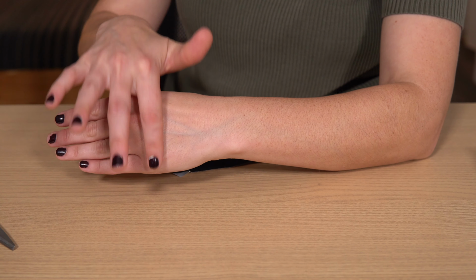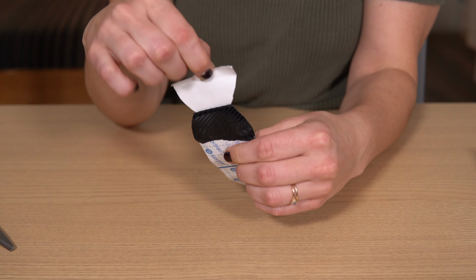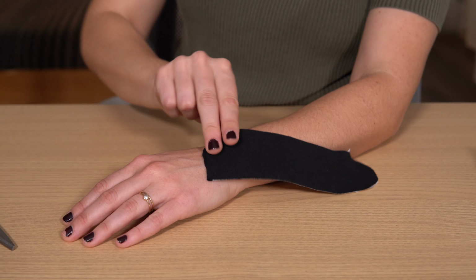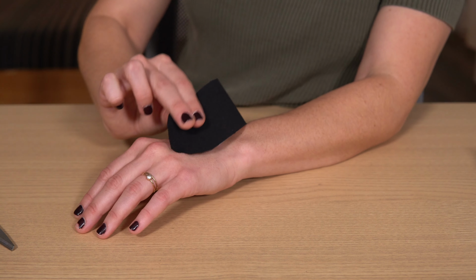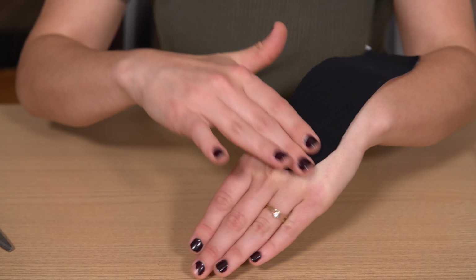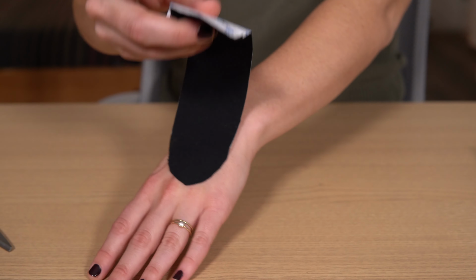So from here, we are going to put down our first anchoring point, which, as I mentioned before, is going to be right below the level of your knuckles on your affected side. And you're taking the paper backing off the first anchoring point. And you'll see I had a little bit of trouble with this trying to do it myself. So as I mentioned before, it can be helpful to have somebody else help you with this. That first anchoring point, we're just sticking down right below our knuckles and rubbing because the adhesive of the tape is activated with heat. So we're warming it up so that it will stick a little bit better.